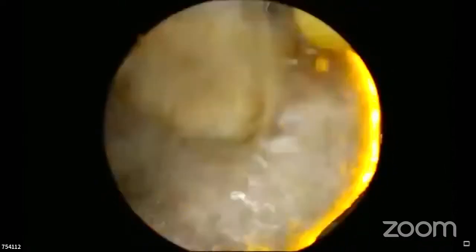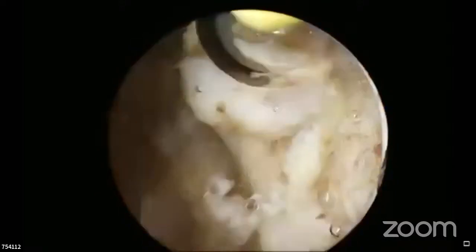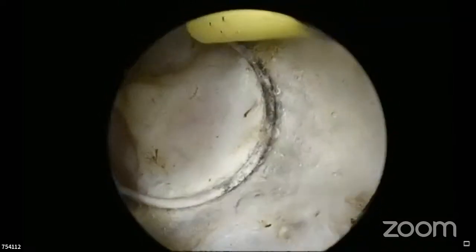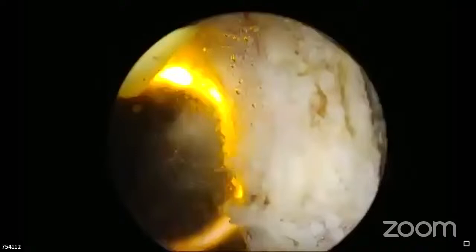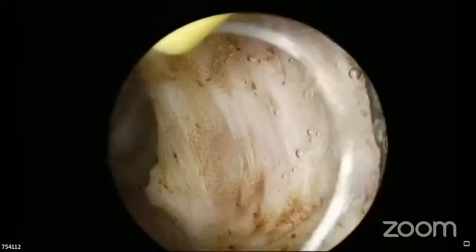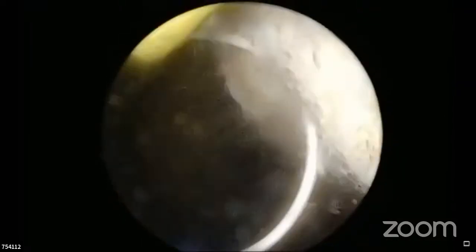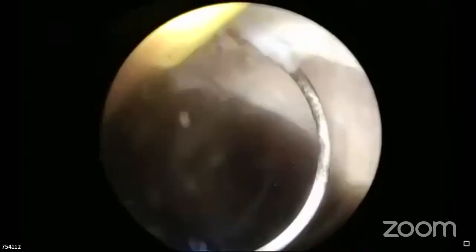Yeah, I think this is an excellent demonstration of 2 cases in which 2 different techniques have been shown of the resection of the prostate, and most of the points we have already discussed. The message is only that one has to understand the anatomy of the prostate. They should know the blood supply of the prostate. They should know the landmarks. Where is the capsule? Where is the Veru? Where is the bladder neck? And accurate resection has to be done. One should be slow, steady, and have a good hemostasis at the end, and ensure that there are no chips or anything left behind.